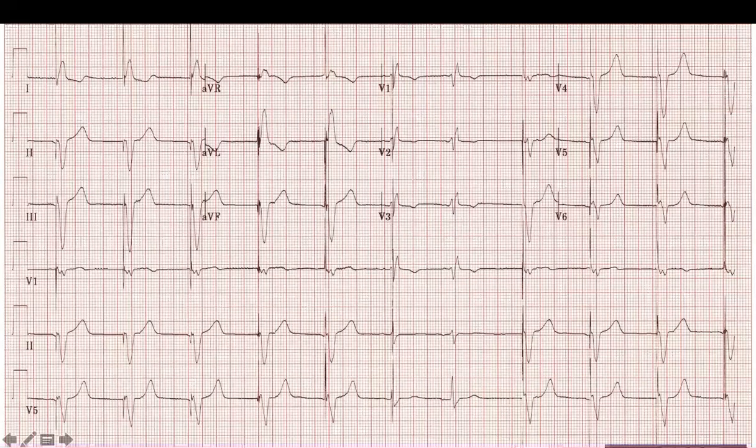There is pacing at the atrium before the P wave. Where exactly? At the Q exactly. Let me go back again.